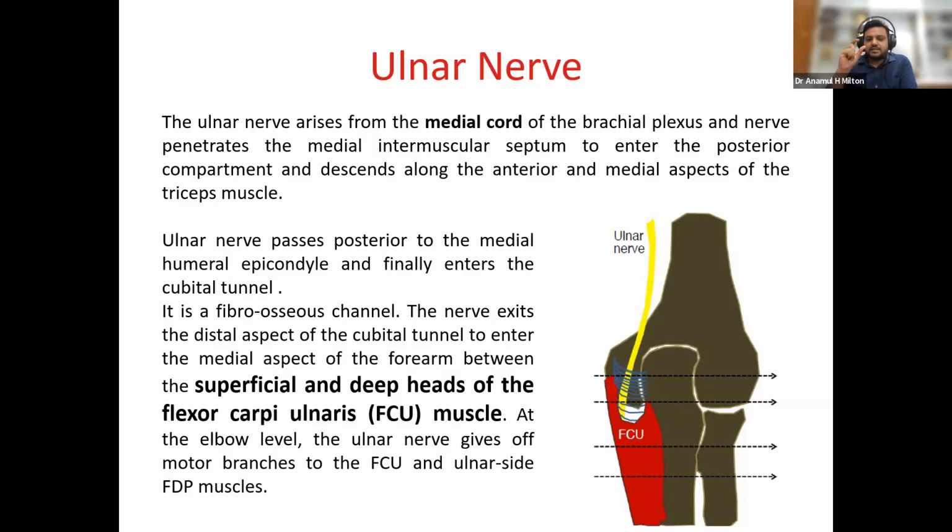This is called the fibro-osseous channel. So this channel is, many times, entrapped and causes ulnar nerve entrapment.